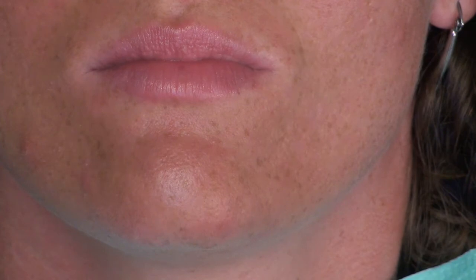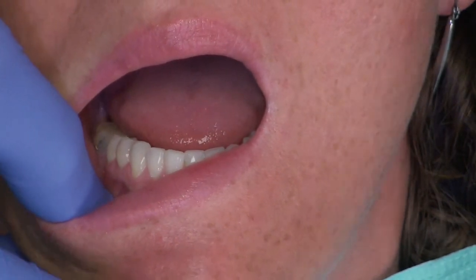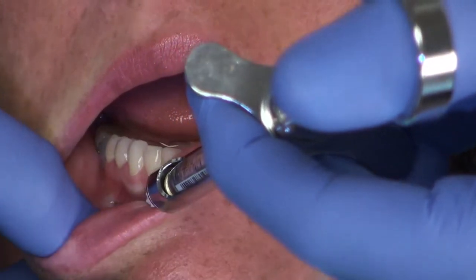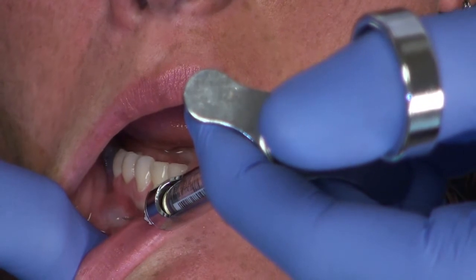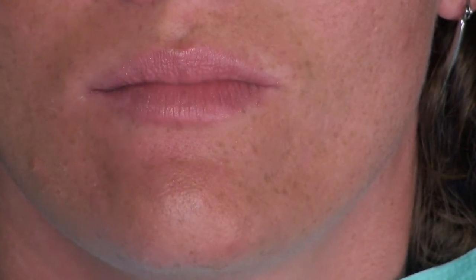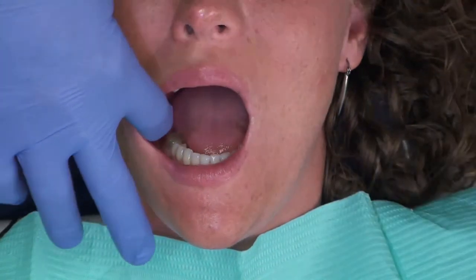What I'm going to demonstrate today is the scan and beginning of the process of restoring tooth number 28. So I'm going to give this local infiltration, and we're going to check our time as we do this. I gave about a half a carpule of local infiltration. Let me go ahead and close, and while that's taking effect, let's go ahead and begin our scanning process with the NEVO scanner.